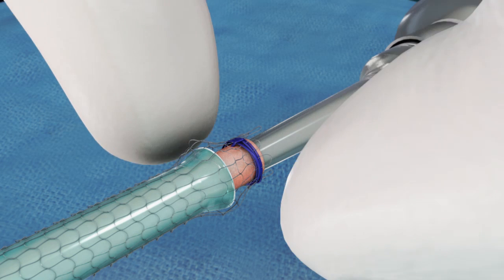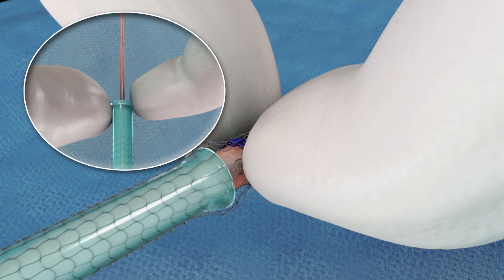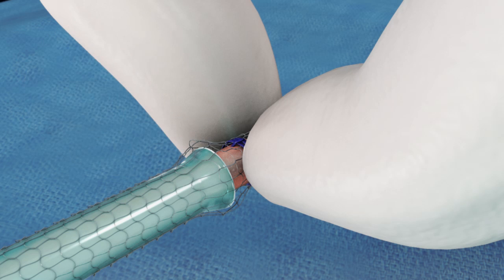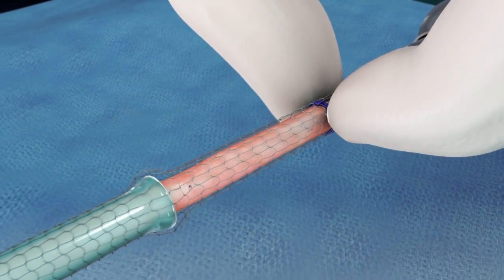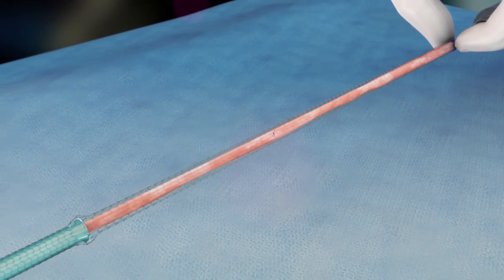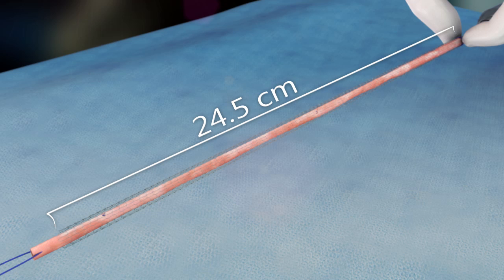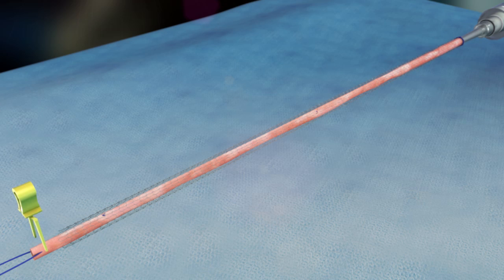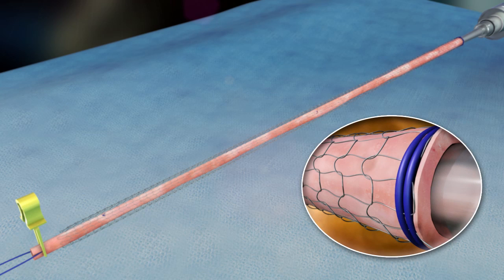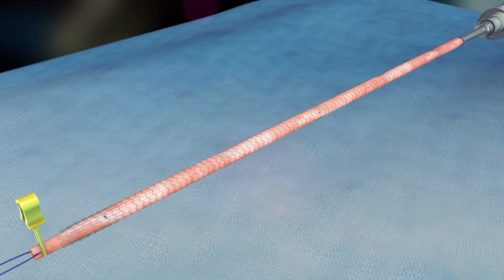Next, have an assistant anchor the cannulated end of the graft. Then, grasp only the delivery tube and pull it back off the vein to deploy the mesh. Feeling a small amount of resistance is normal as the mesh deploys over the flared end of the delivery tube. If the mesh becomes stuck on the delivery tube, cease pulling the tube and push the remaining portion of the mesh towards the cannulated end. Once the mesh has been fully deployed, clamp the open end of the vein and gently inflate. Inspect the conduit, ensuring the outside of the vein makes contact with the inside surface of the mesh along its entire length.